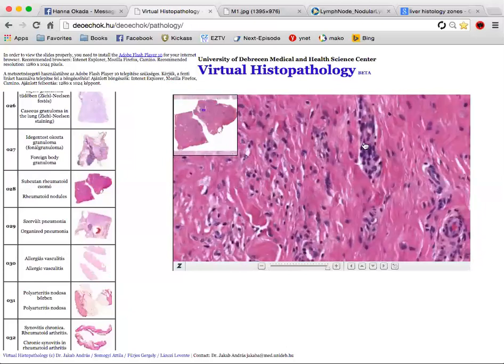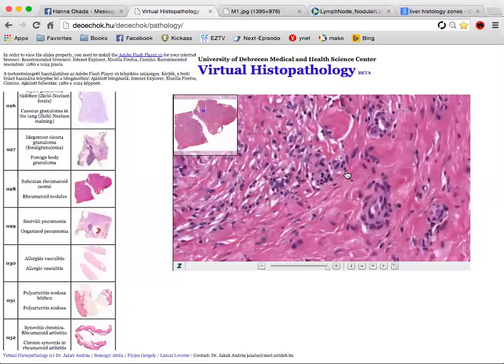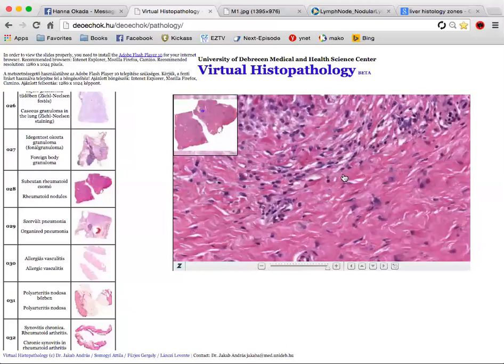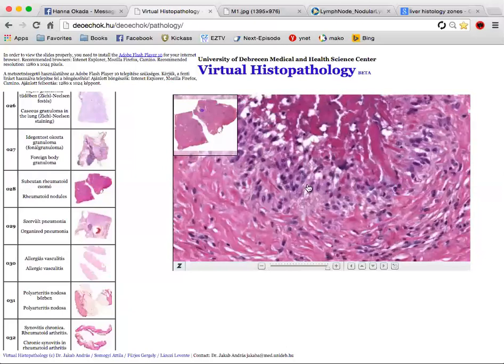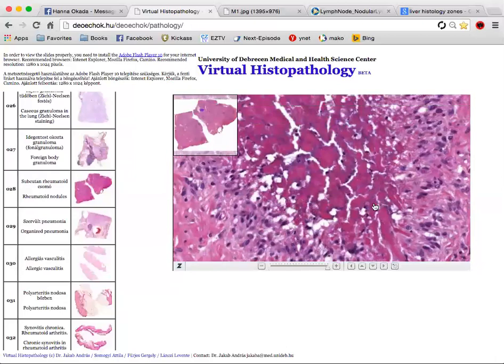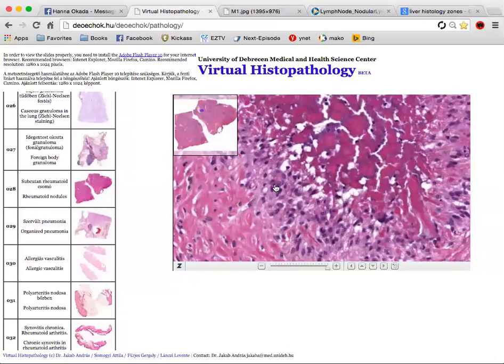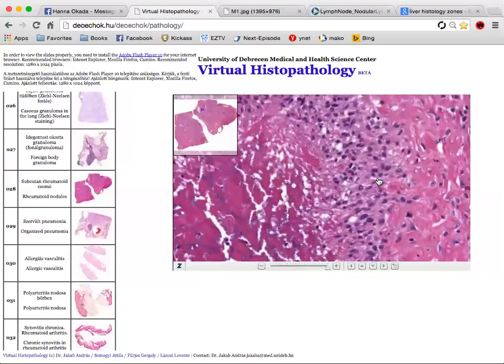They may look something like this. But I haven't seen a really nice one that I can show people. But there might be some giant cells in the periphery. What's important is fibrinoid necrosis and the epithelioid cells here. So that's what's important.